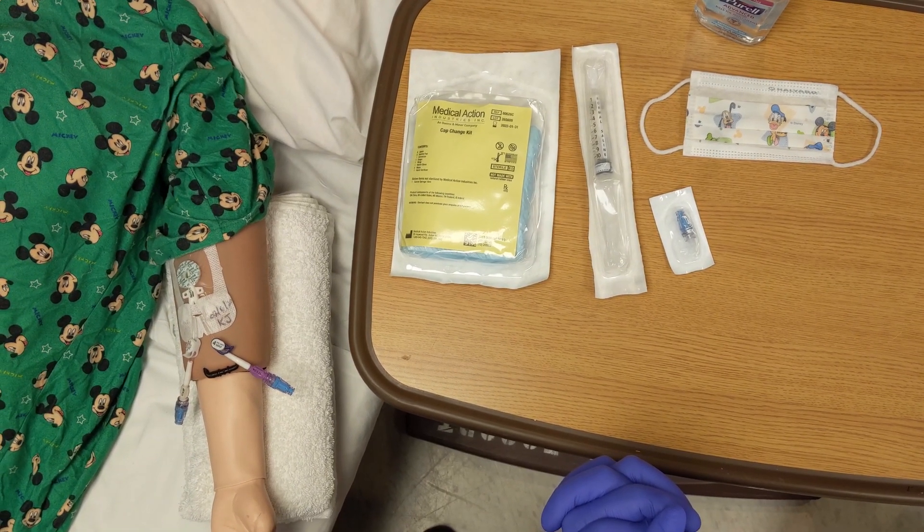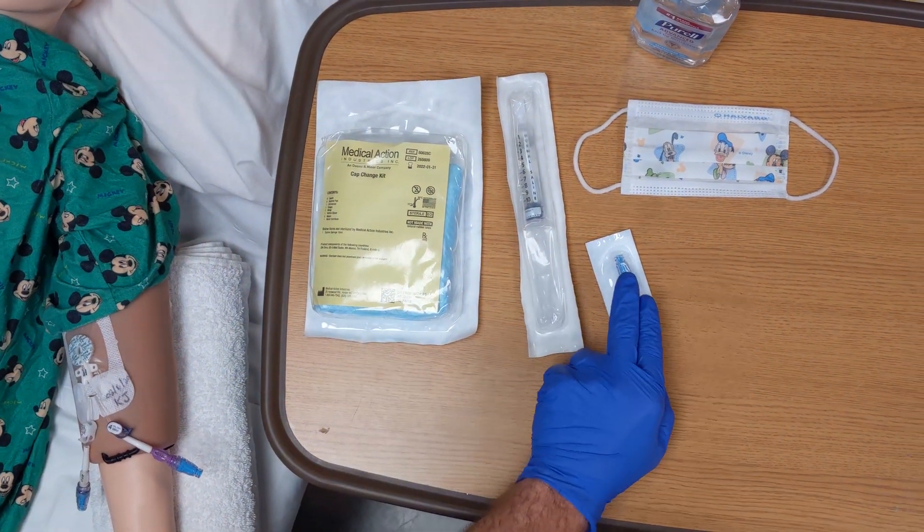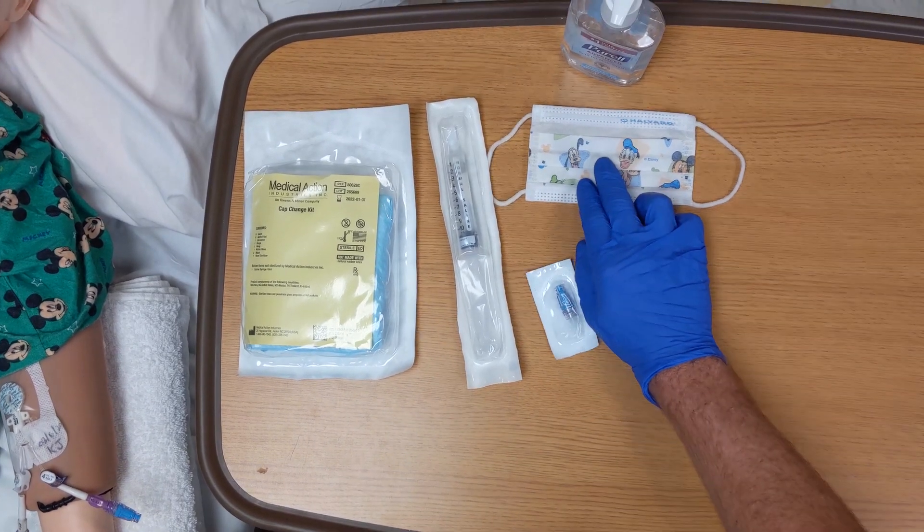First, you want to assemble your supplies. You need a sterile cap change kit, an additional cap for each extra lumen to be changed, and enough masks for the patient, yourself, and everyone in the room.